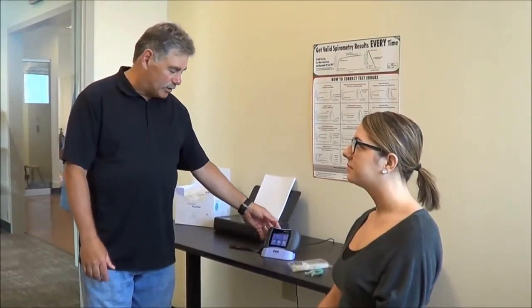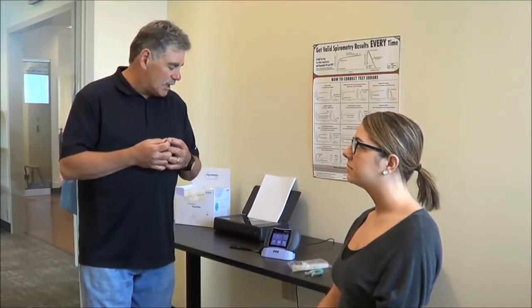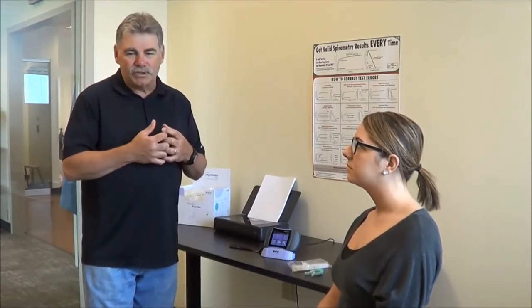So today we're going to do spirometry on the EasyOne Air Spirometer. In spirometry, the coaching of the patient is very important, and the maneuver requires three acceptable tests to be done. There are three components that need to be done correctly.